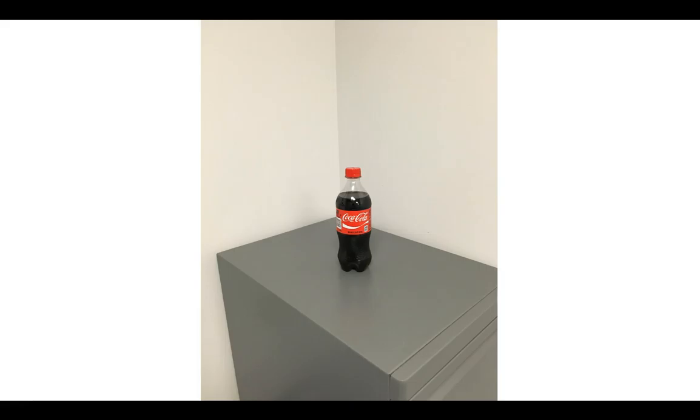If I had never seen a bottle of Coke, or if I didn't know what kind of Coke this was, Diet Coke, Vanilla Coke, Cherry Coke, I could look at the label and I could know what was in this bottle of Coke. Same with a CT scan. Again, the brown liquid represents the images. The outside label represents the DICOM header.